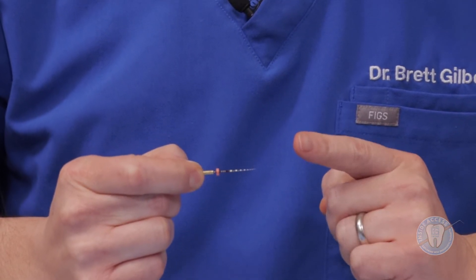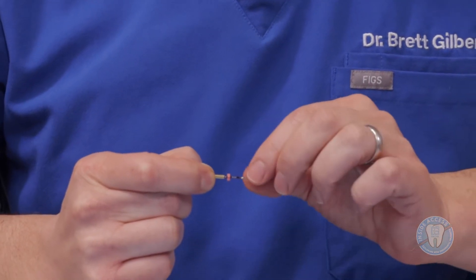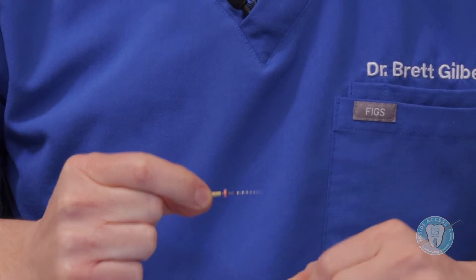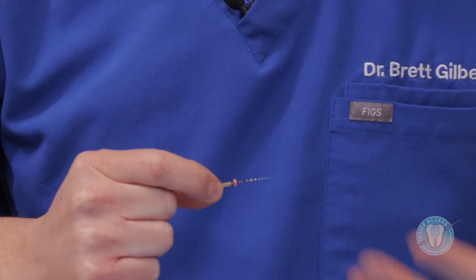The next file in the Traverse system is a glide path file. This is a 13 at the tip with an 06 taper. It's a very flexible, movable and strong instrument that allows you to truly instrument the canal even without any hand preparation. This would be taken essentially to two working lengths. The Traverse system also includes an 1806, and your selection of which one you opt to use might depend on how tight or open the canal is to begin with. You could use both if you had a very tight canal, as a progressive way to open and create a very nice glide path.